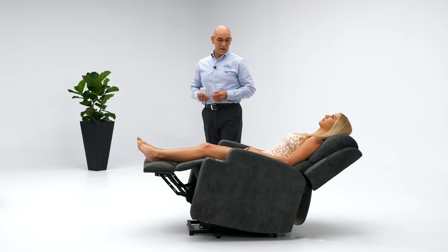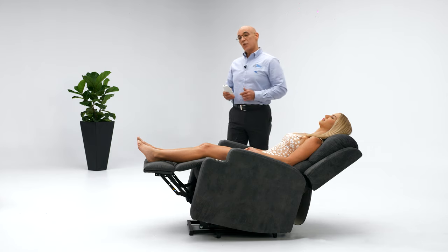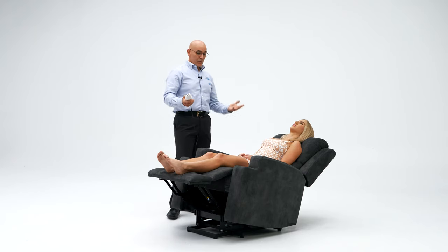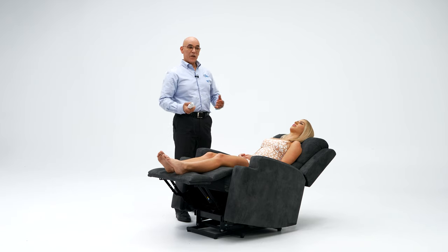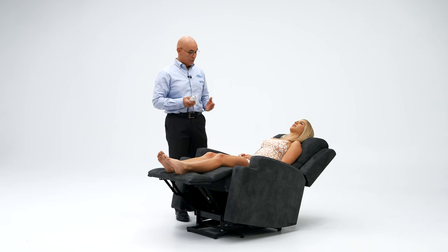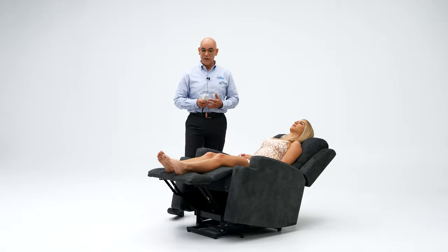For a lot of people that spend time in their chair, it does recline pretty low so they can enjoy a small nap in the chair. Also, by getting into that recline position and getting the feet and the knees at almost the same level as the heart, it will slowly start draining fluid and blood towards the body, assisting with better circulation and blood flow.